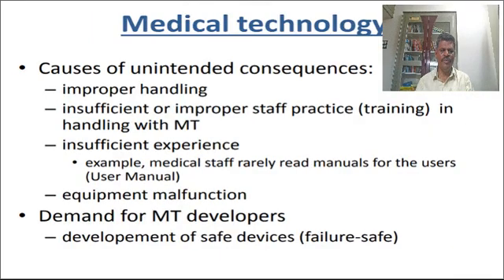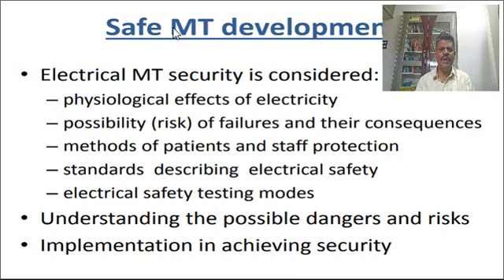Next thing we can go for is safe medical technology development. That means physiological effects of electricity, possibility of failures and their consequences, methods of patient and staff protection, standards describing electrical safety testing modes, and implementation in achieving security and understanding the possible dangers and risks.